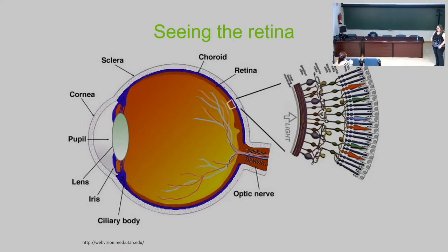I'm conscious that a lot of you are familiar with a lot of the work that's done in the eye, and our goal is really to look through the anterior optics and correct the anterior optics in order to look at the retina and look at the individual layers at the back of the eye. And we want to do this at the cellular scale so that we can understand how things change in retinal disease and how things change in retinal function, layer by layer or cell by cell. That's really the long-term goal, and we're working on getting to that.